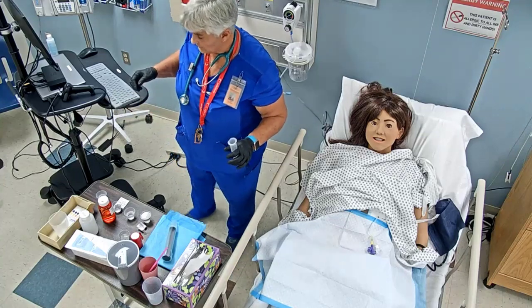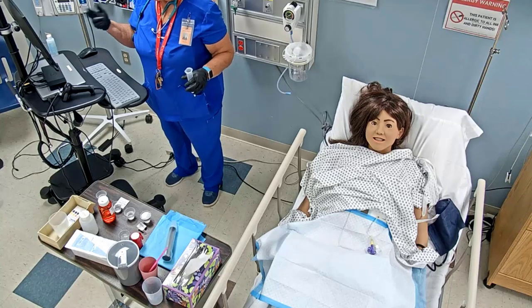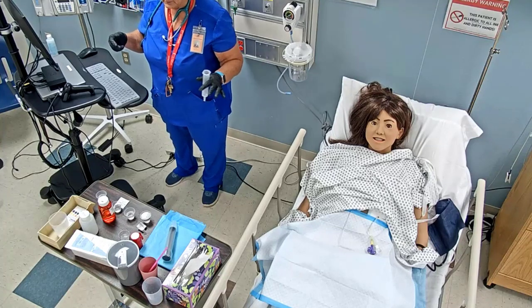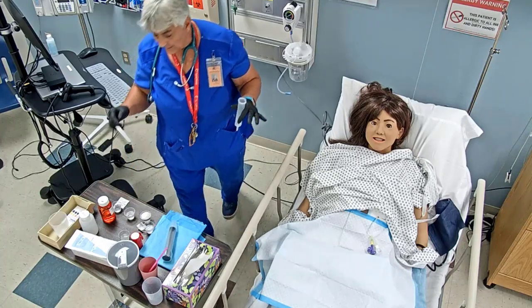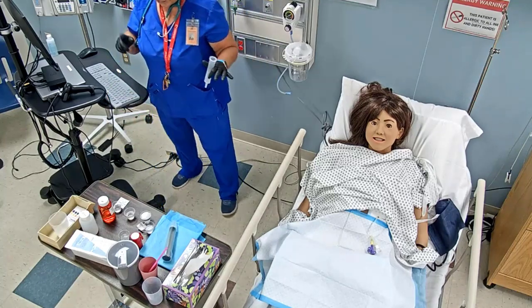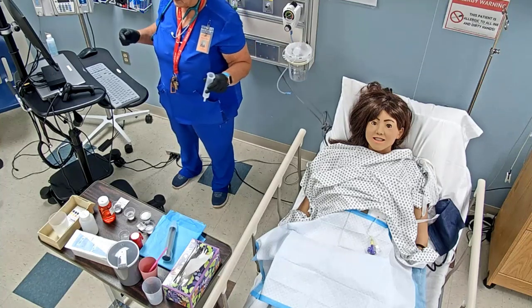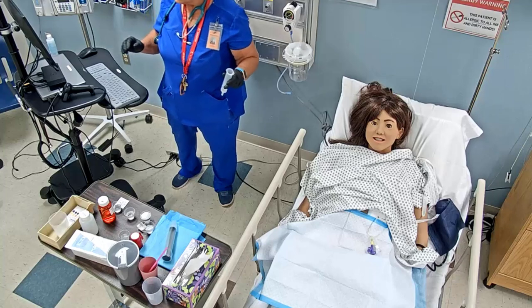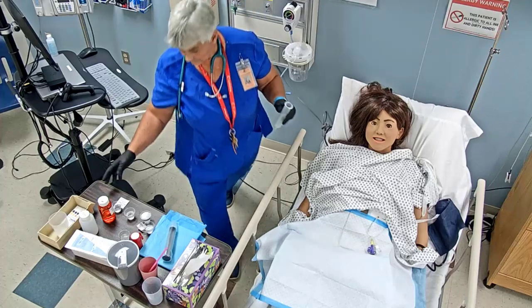I need to make sure, okay, so we're giving the metoprolol. It's in 30 mils, and then we're going to flush with 15. Actually, we're going to flush first with 15, so we've got our flush 15 to begin with, and then we're going to give the med, which is in 30, flush again in between with 15. We're going to give the next med, which is at 15, and then we're going to flush again at the end.